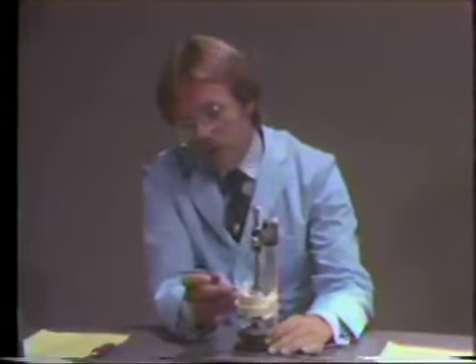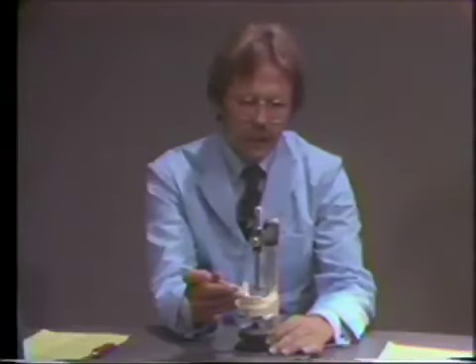I will not have to over-contour greatly. I may have to do a slight amount of disking of the unchanged, non-restored abutment, my potential non-restored abutment tooth, the tooth without any caries, the bicuspid. A very small amount of disking will probably give me a nice, adequate parallel surface for a guiding plane on the lingual of this abutment tooth.